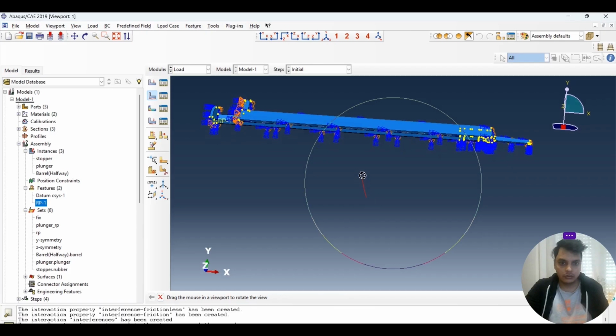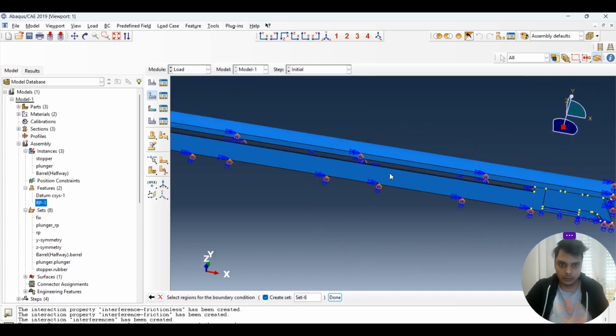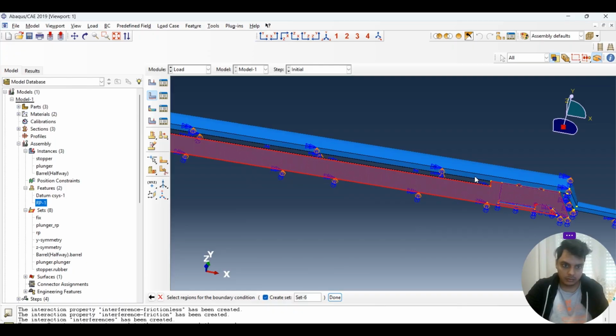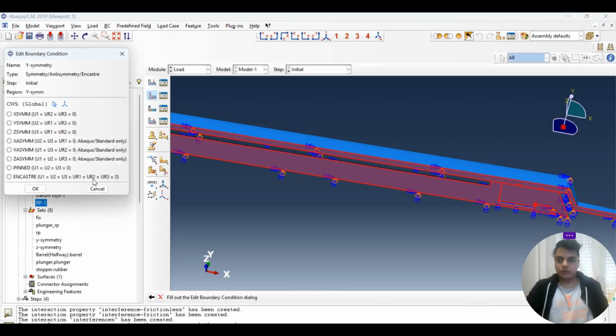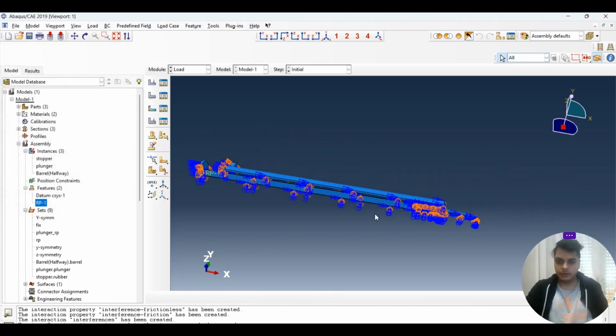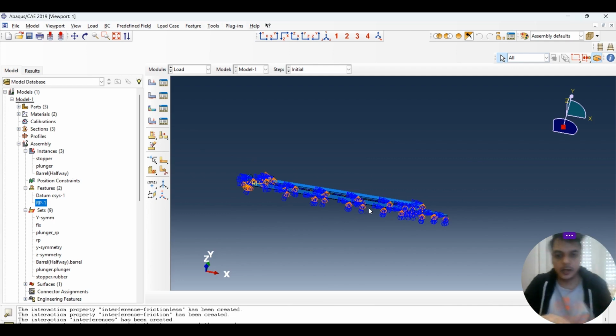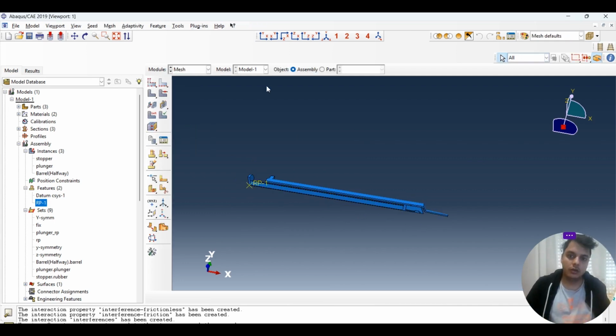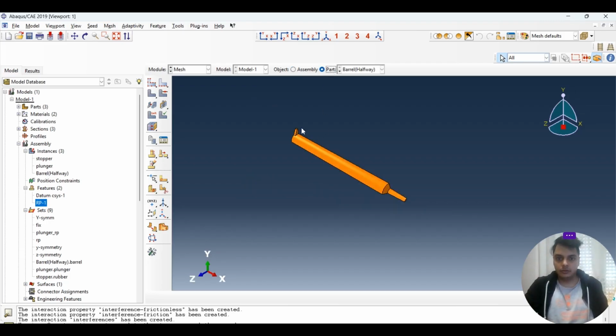Going to be this one. Okay, well, fine. So we define it here. Now I guess everything is all fine. The only thing left here is the mesh. So we go to the mesh part.